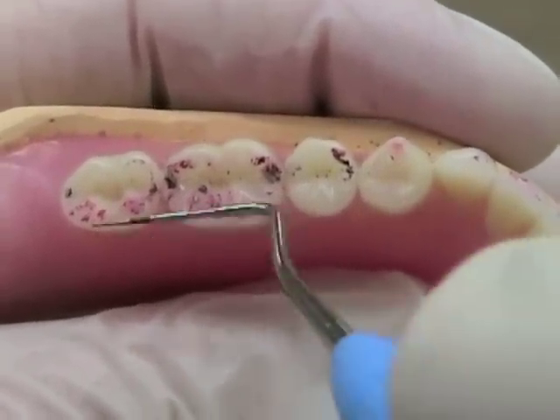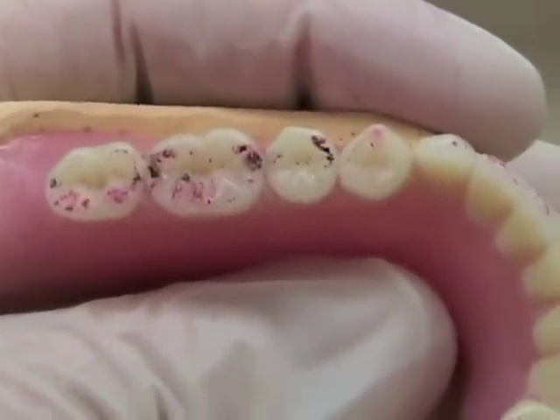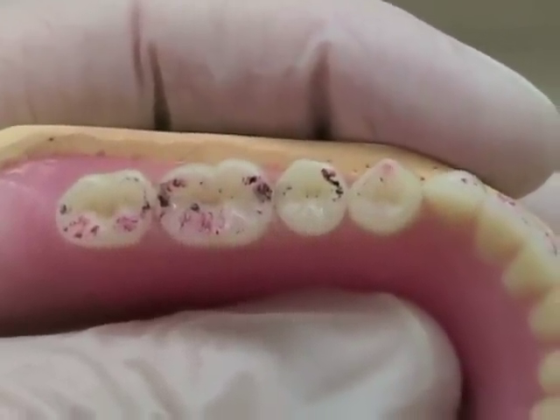Remember, the maxillary lingual cusp should be running right down the middle of your ridge, and these teeth should be set right over the top of that ridge so that the central fossa is indeed centered right over the mandibular ridge.